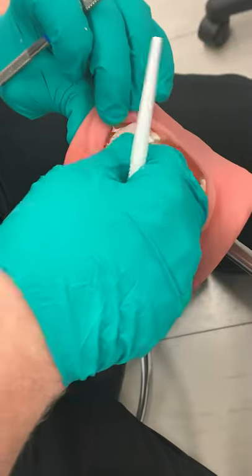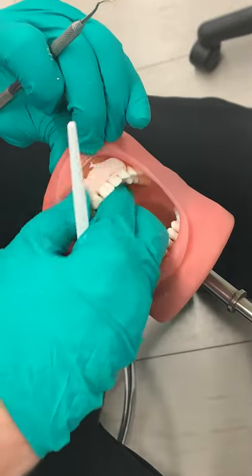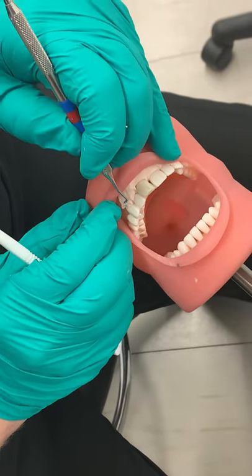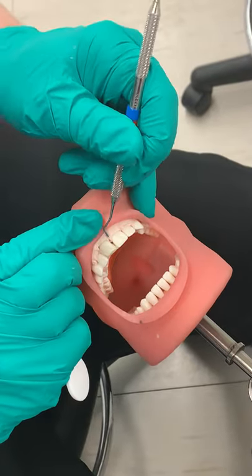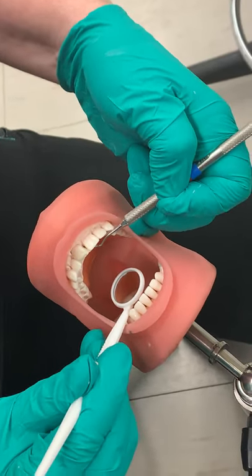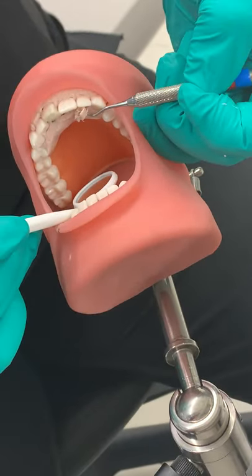Keep working with it — your fingers work pretty well. You don't want to dig into it because that makes lines; you want it nice and smooth. It takes time to get this done. Keep working and interlocking it, and we're going to stop the video now and show you the final product.